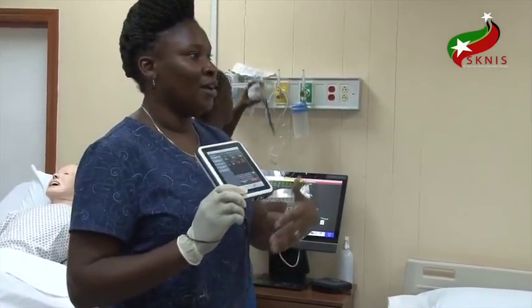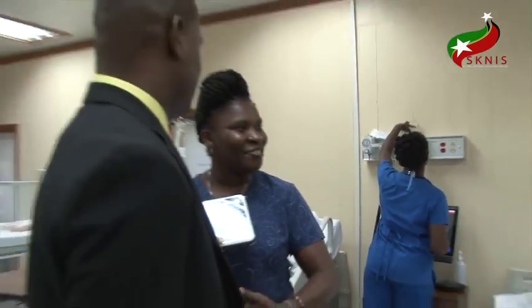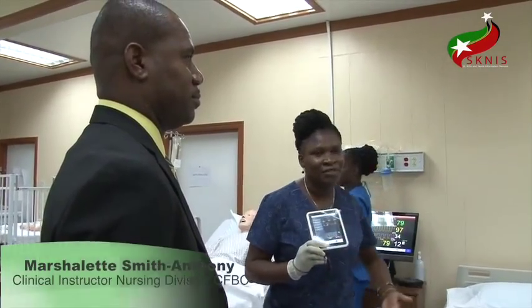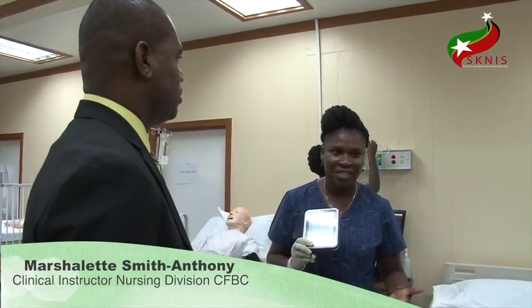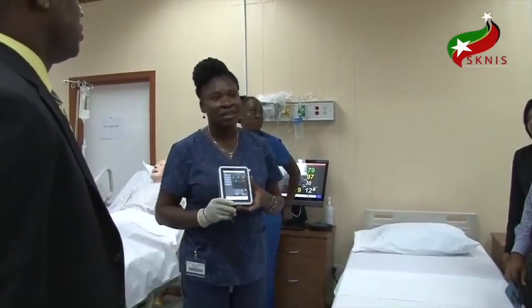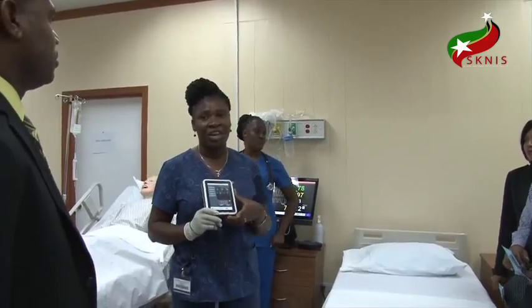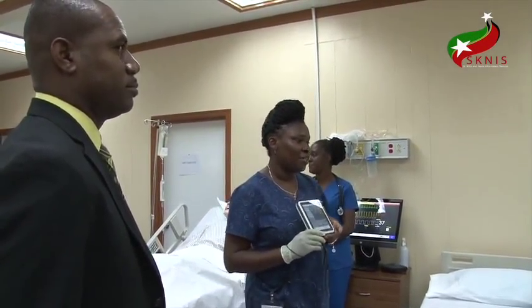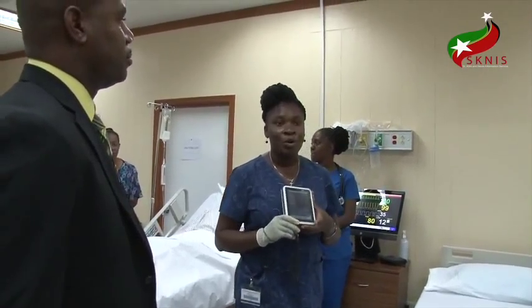We can use the minister's voice and record it for our male patient, or we can use any female's voice and record it for our female patient. The scenarios that we use for our simulators are quite costly. We have pre-programmed scenarios that we must buy from the manufacturer, but we can also write our own programs.